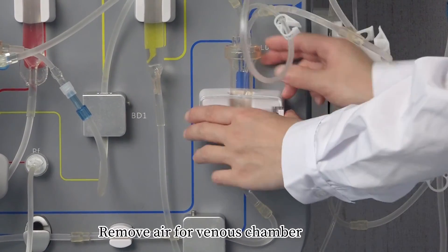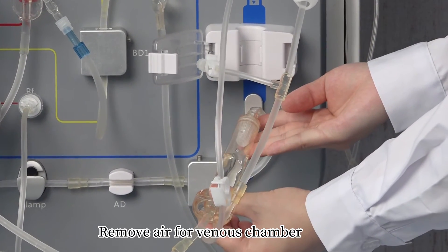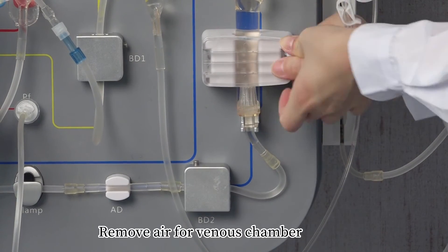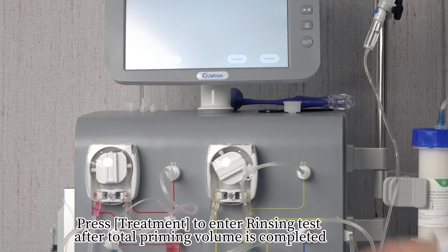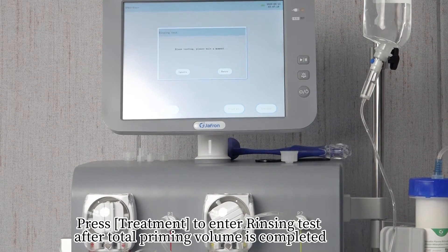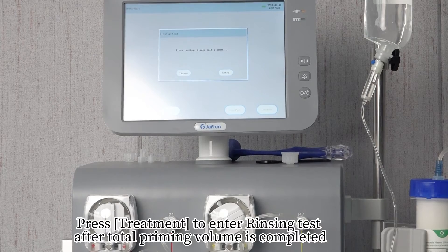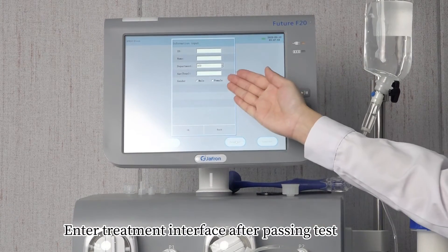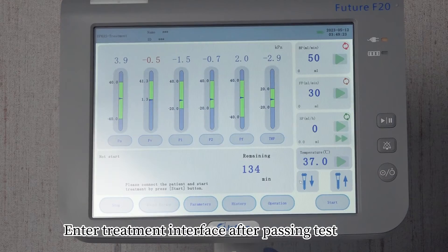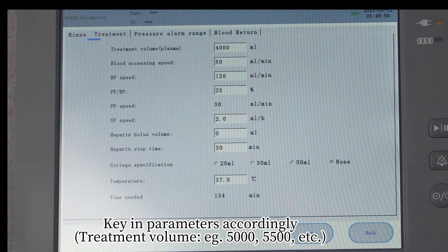Remove air from the venous chamber. Press 'Treatment' to enter the rinsing test after the total priming volume is completed. Enter the treatment interface after passing the test. Key in parameters accordingly.